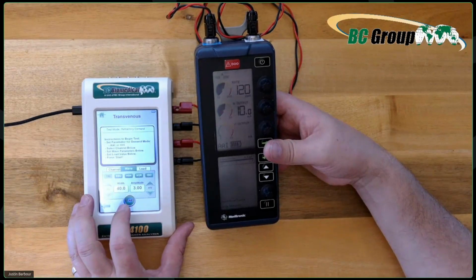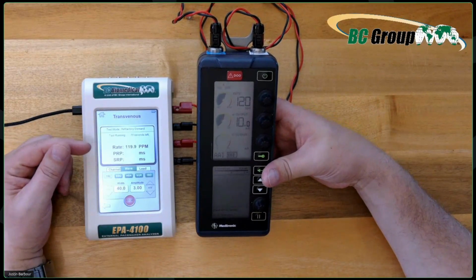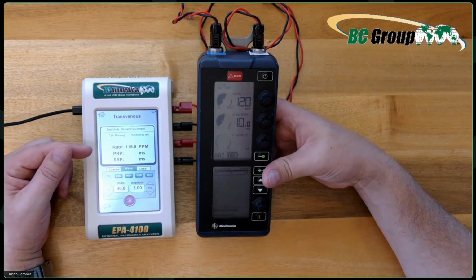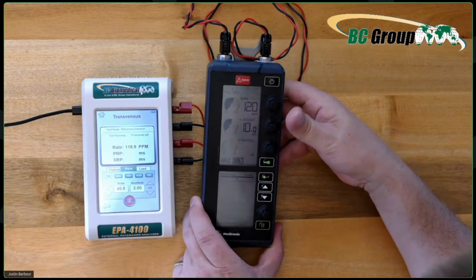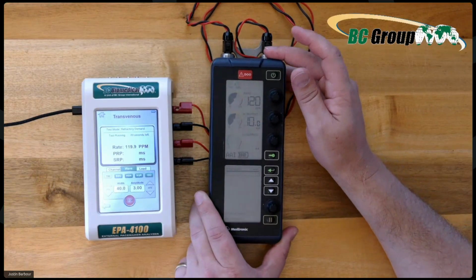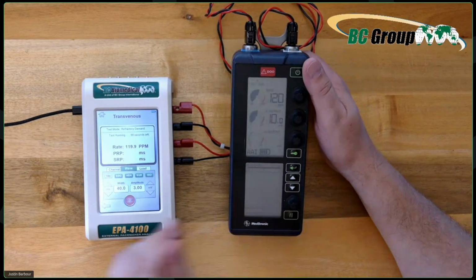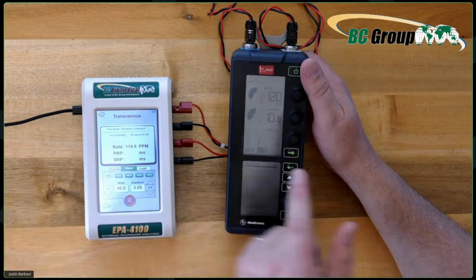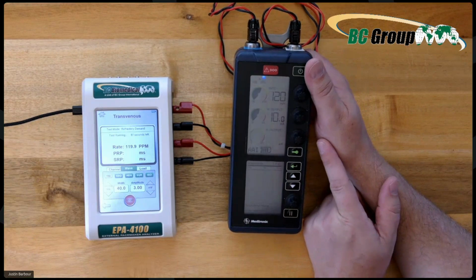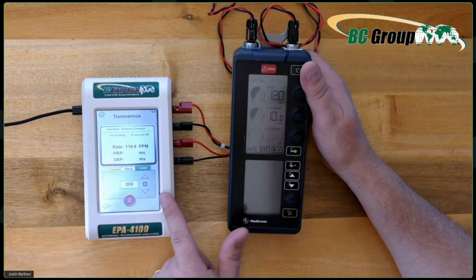And we can hit start. And what it's going to do is it's going to measure it. And I don't really know what the rest of the test does. Now, obviously, I haven't even been trained on this device for all its capabilities. What I can tell you is that it's definitely measuring for me to do something on this device, and I don't know what that is. But we can also adjust our load.